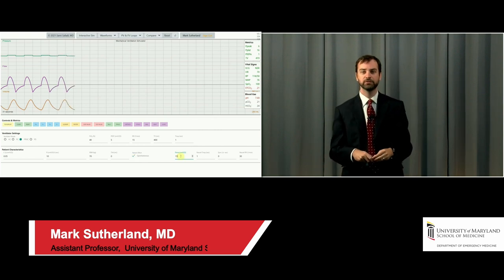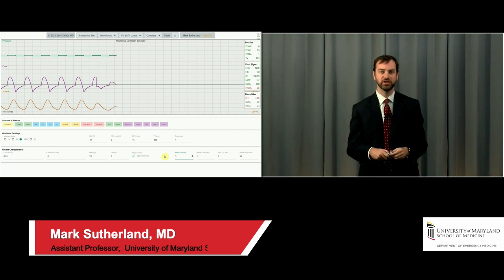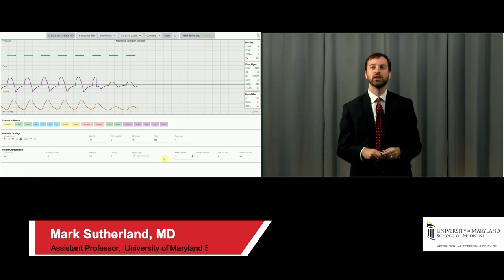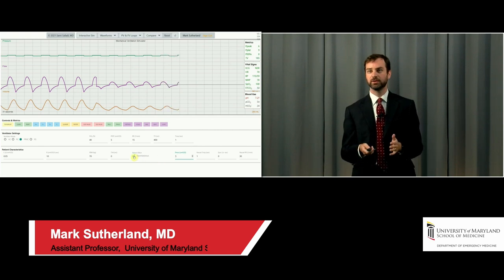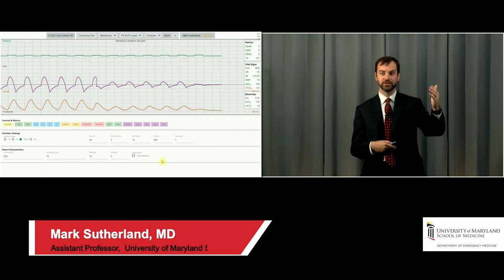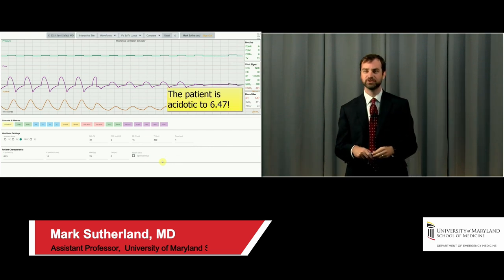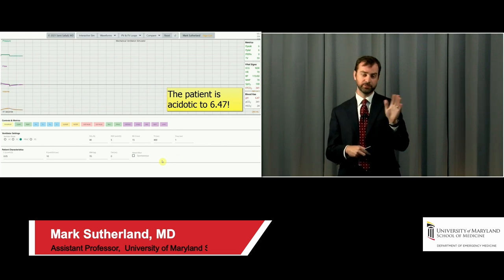And so to finish off this video, what I'm going to do is decrease the PMUS there from 15 to 5, and then very shortly thereafter, I'm going to uncheck the spontaneously breathing box. Now we have a problem. The patient's getting almost no tidal volumes. I think they dip to the double digits. The pH swings from 7.7 to 6.47, which is as low as it goes. Now, the good news, that's the bad news.